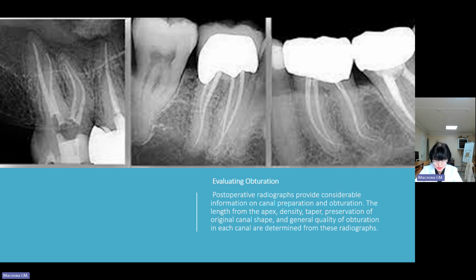Fractured instruments. This happens especially if the canals are significantly curved and instrumentation stress becomes greater than the mechanical resistance of the instruments. And when the clinicians don't use nickel-titanium flexible instruments, it is quite a frequent complication in common practice.